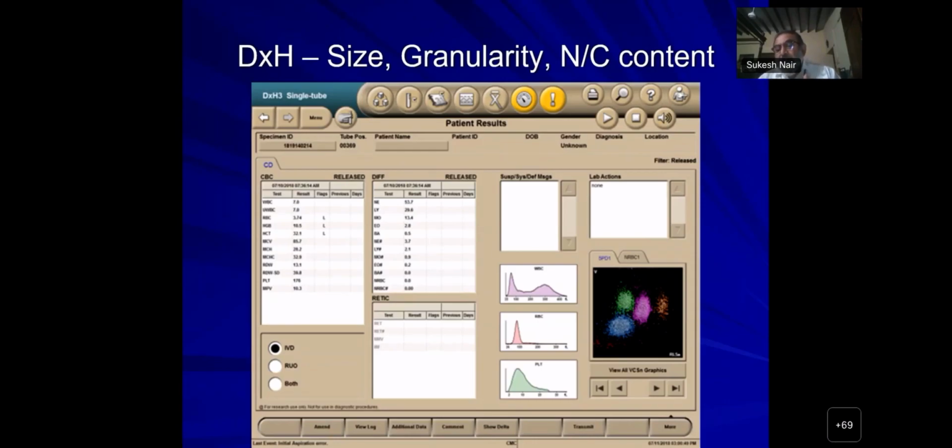Compared to an equally populated cell, which is the pink population, which has got more scatter than the lymphocyte and also double the size of the lymphocyte. They are the neutrophil. Then you have the orange population, which is the same size as far as the y-axis is concerned as neutrophil, but has more scatter than the neutrophil.